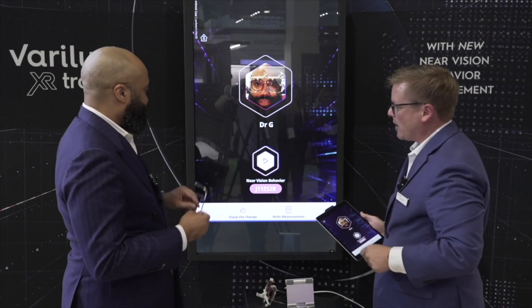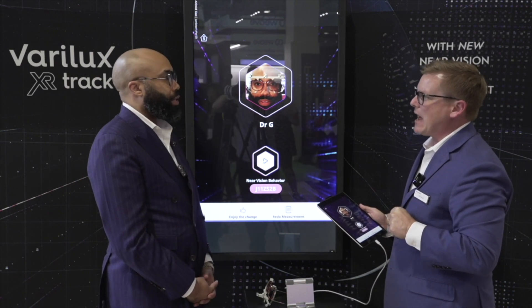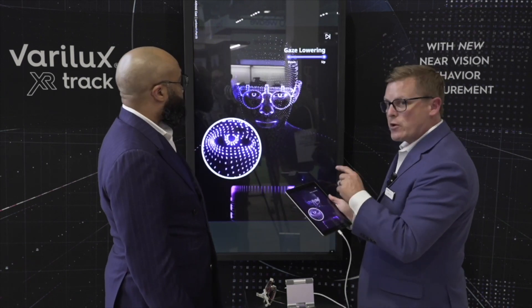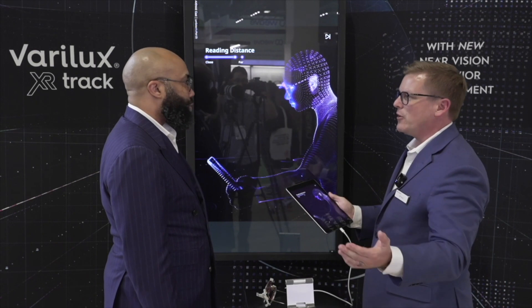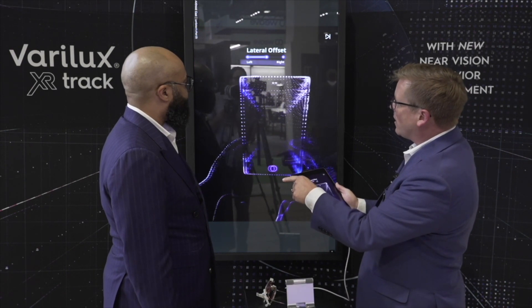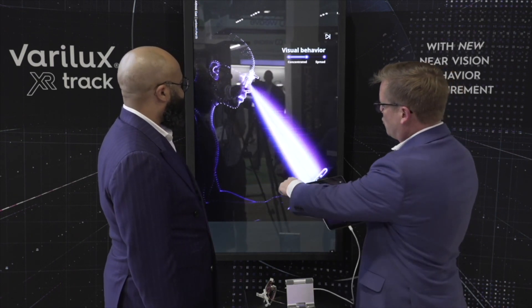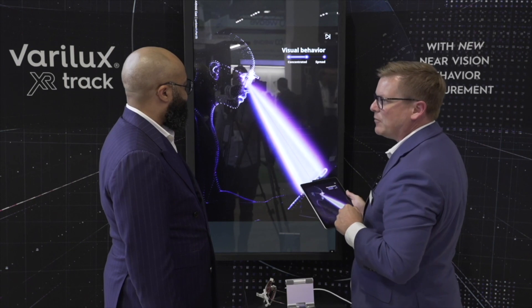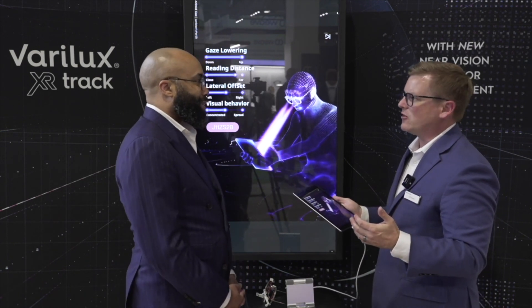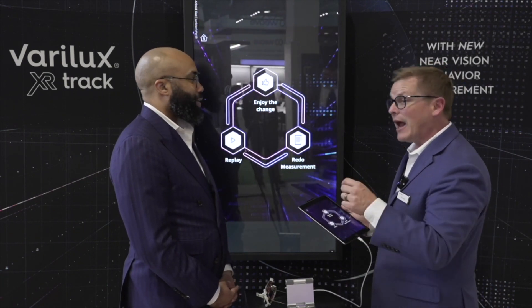This seven-digit alphanumeric code consolidates all four measurements into one code, and that's all you need to give to the lab to calculate the lens. You can also show the patient how they measured up across the four elements: reading distance, lateral offset, downward gaze, and whether they were more of an eye mover versus a head mover. This is what's great about the Eye-Ruler 2 and Varilux XR track — you can demonstrate the additional time, effort, and care put into their eyewear, truly personalized to them and only them.